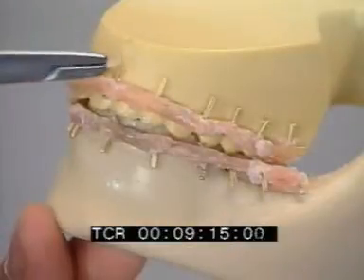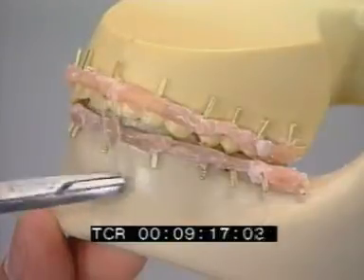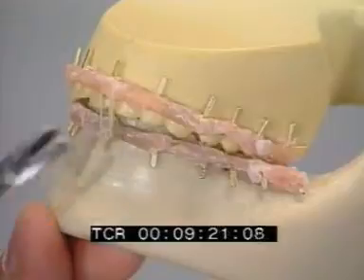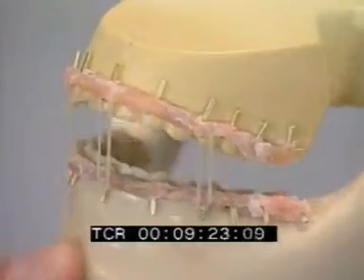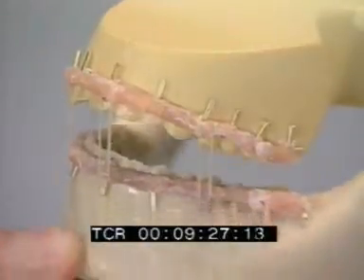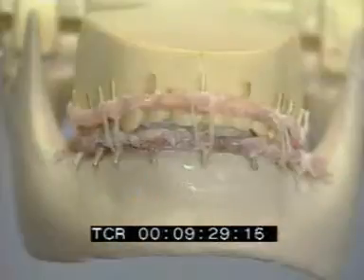For fragment fixation before reduction or for functional training, elastics are helpful. Arch bars support functional training using elastics if tensile forces in angle class 1, 2, or 3 are needed.